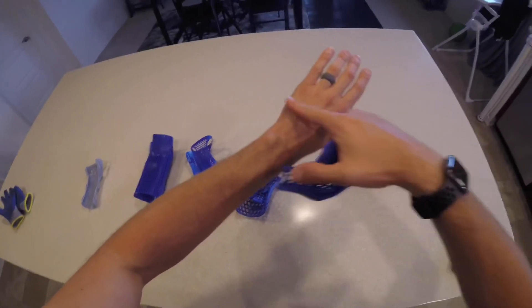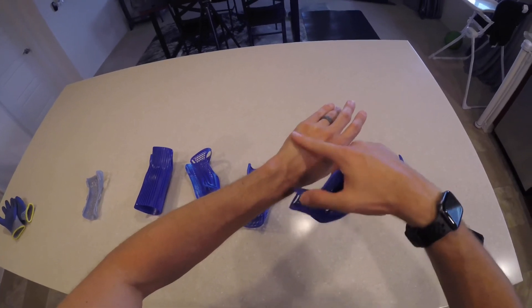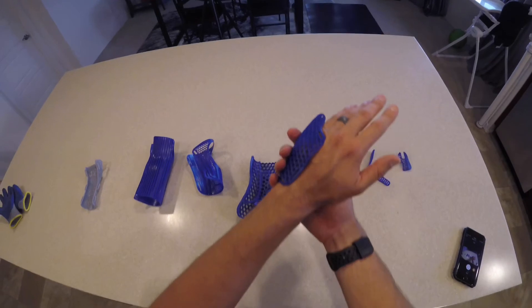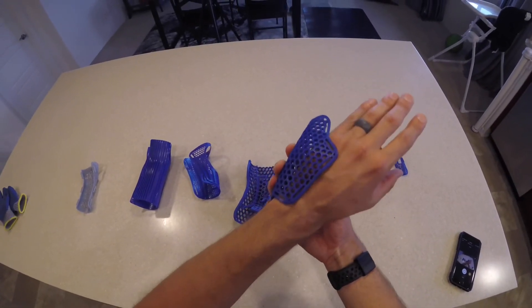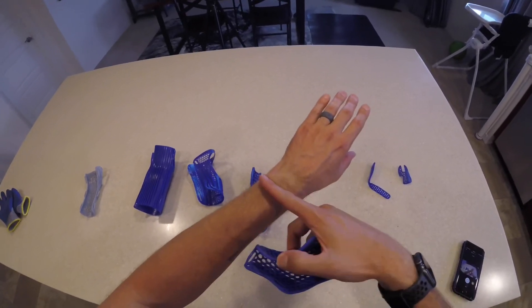People do sometimes get fractures further down in the hand - it's less common than up at the wrist, but if you do have a fracture there, more like what PRUSA was showing initially, you would want to cover the fracture and stabilize the wrist, so you'd want the splint to come down below the level of the wrist.